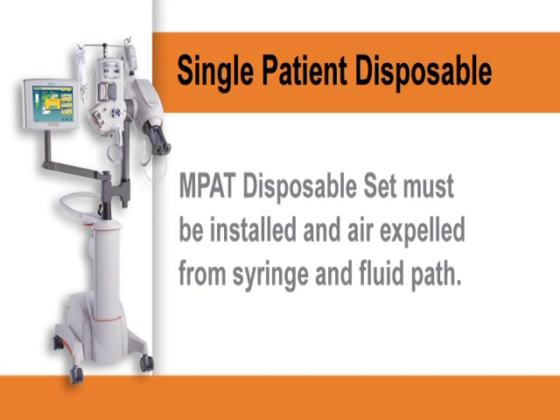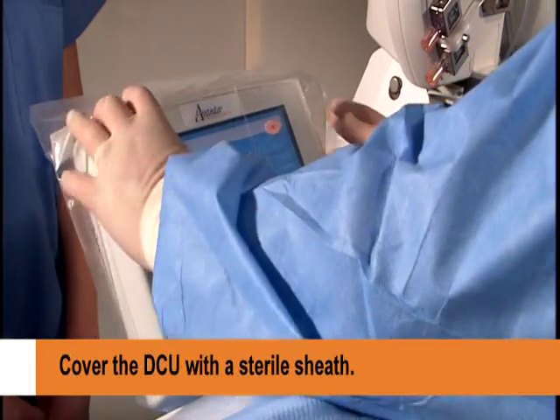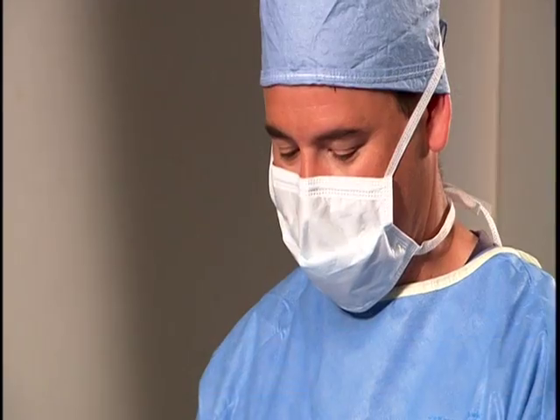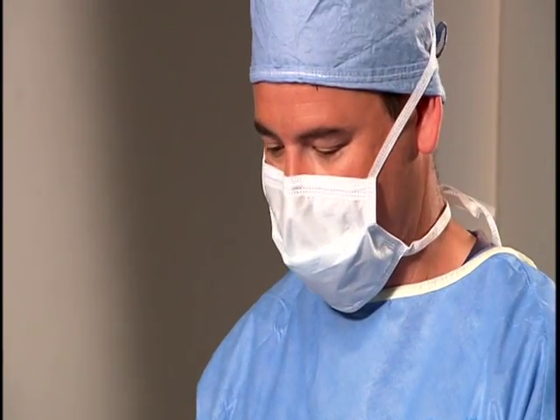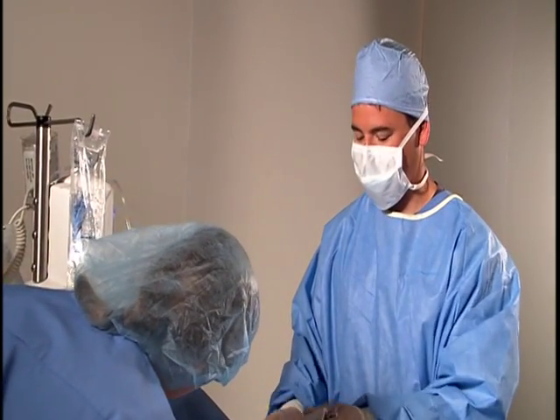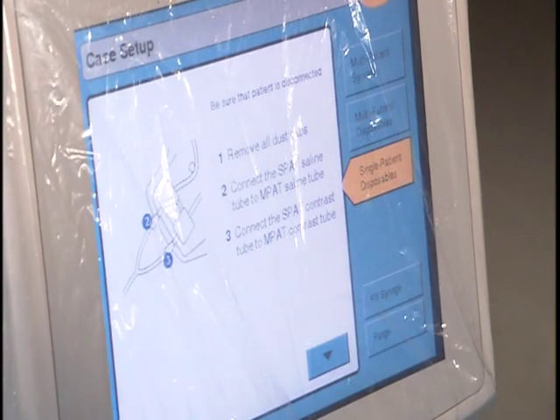To install a single patient disposable set, verify that the multi-patient disposable set is installed, all air has been expelled from the syringe and fluid path, and the system is ready to accept the single patient disposable set. If SPAT installation is being performed by a single operator, the DCU must be covered with a sterile sheath. All steps in connecting and purging the SPAT will need to be completed in a sterile field to maintain sterility of the disposable. Select Single Patient Disposables on the DCU.